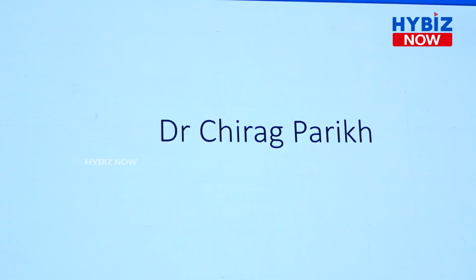Clinical background, the angio, and the IVUS run. Can I have a brief discussion and then discuss about the case?